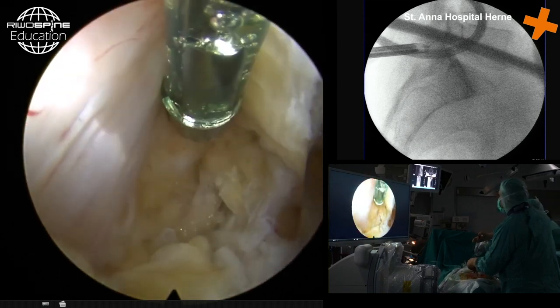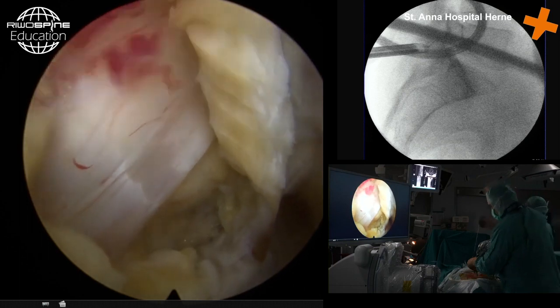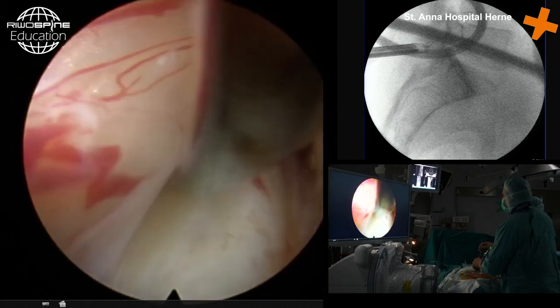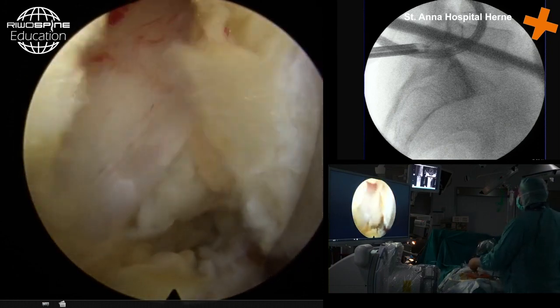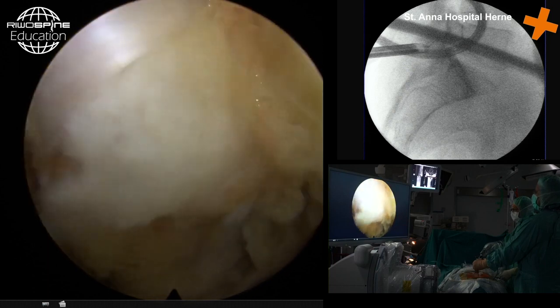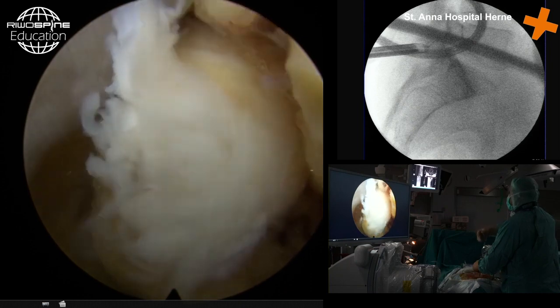So what we already can see is here the herniated material directly below the S1 nerve root. Then I use the dissector. So I medialize the neurostructure and check if there are any adhesions. So now I can go in with the cannula and rotate the cannula. So I medialize the S1 nerve root, make sure that you don't squeeze the neurostructure. And then the pathology is just in front of us and we can resect it.